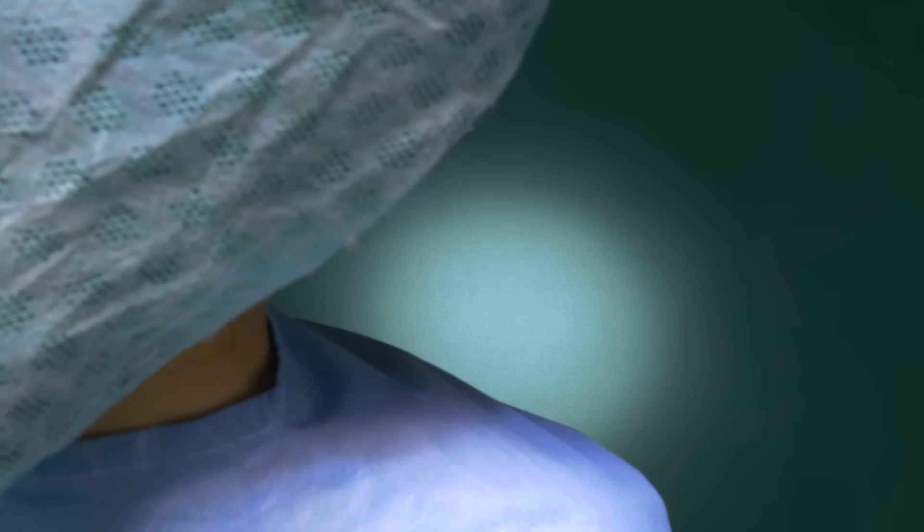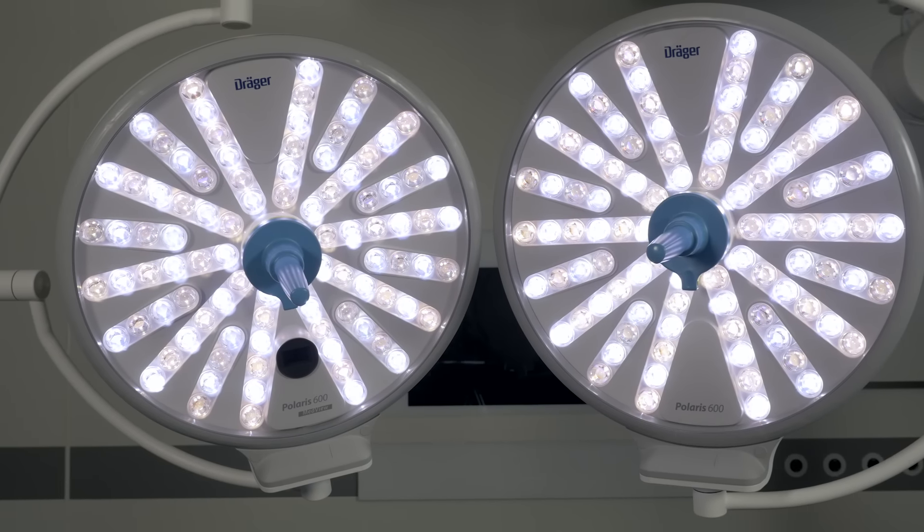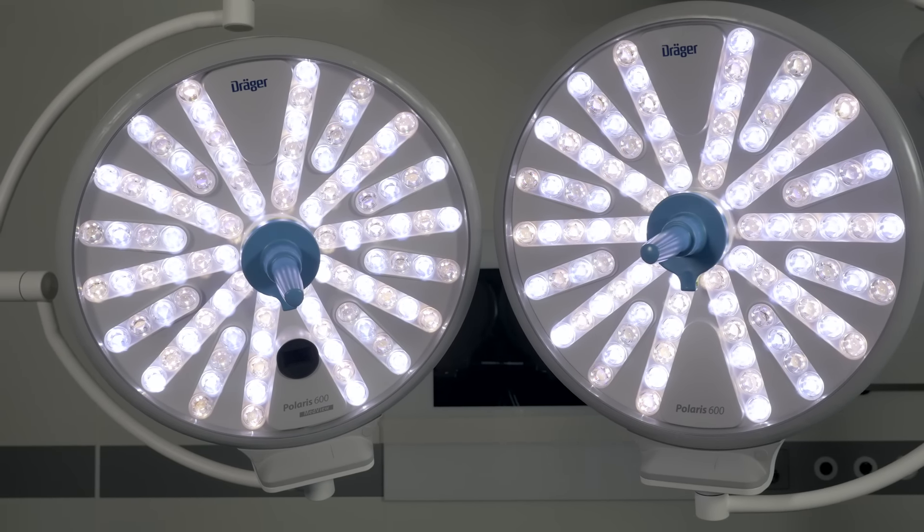Even the deepest surgical cavities are illuminated. The wide light-emitting surface provides homogenous depth of illumination and shadow control.